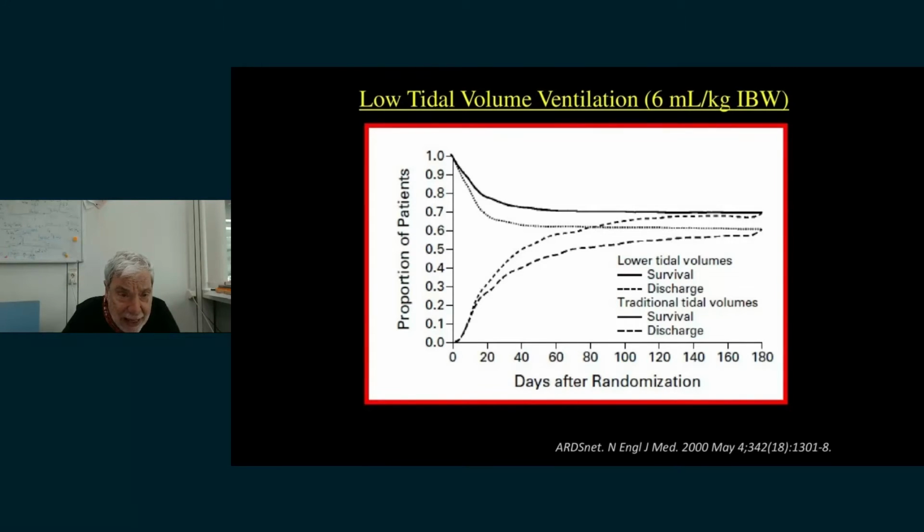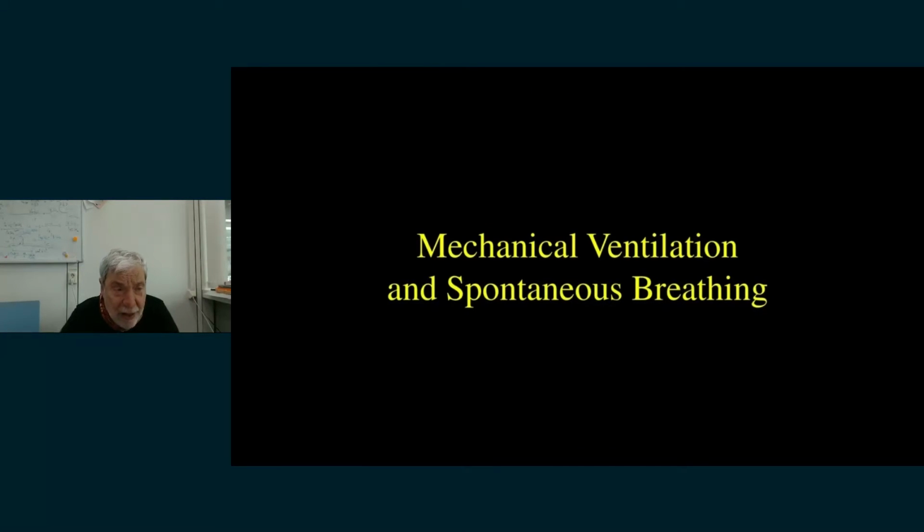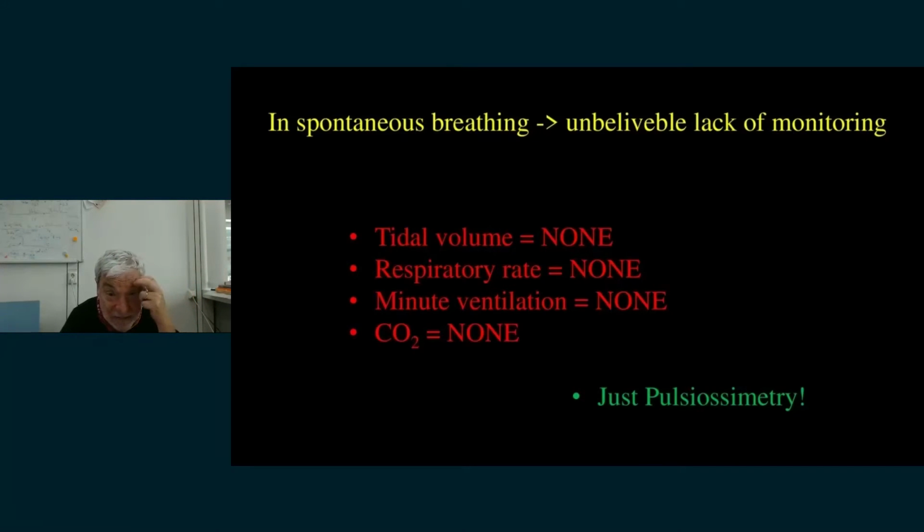Okay? Now, what is spontaneous breathing? What is the real difference between spontaneous breathing and mechanical ventilation? First, in spontaneous breathing, we have an unbelievable lack of monitoring. We do not measure the tidal volume.